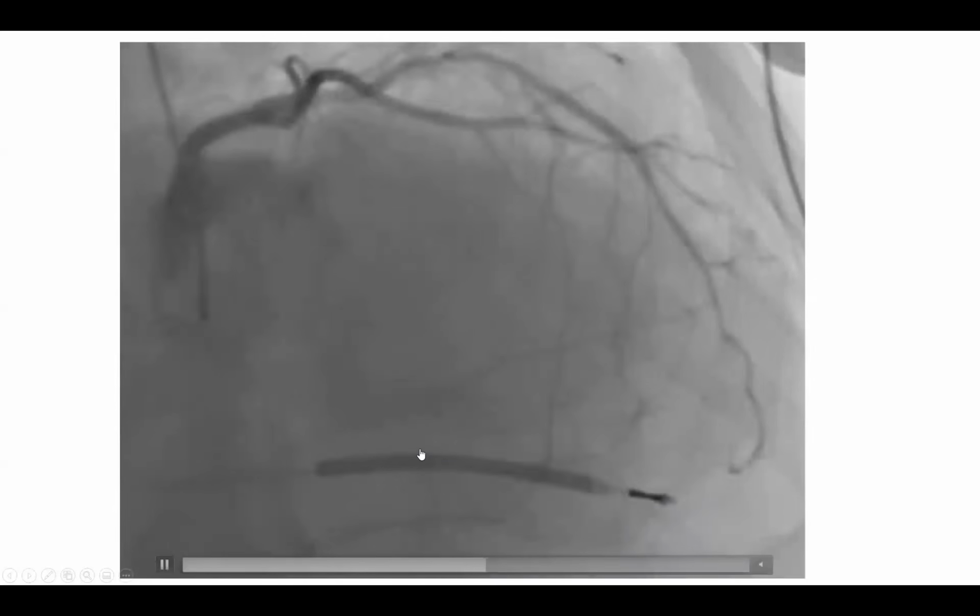That's a very important, actually, interventional board question. It's important to know that when you have an RCA CTO and the LAD is feeding it, the LAD is providing collaterals, and therefore the LAD is providing a much larger territory, double territory, than if you did not have an RCA CTO. Therefore, because it's providing a larger territory, it's having higher flow. Therefore, the drop in pressure and the drop in flow past that stenosis is more dramatic. Therefore, the FFR is more extreme in the presence of collaterals than if you did not have collaterals.